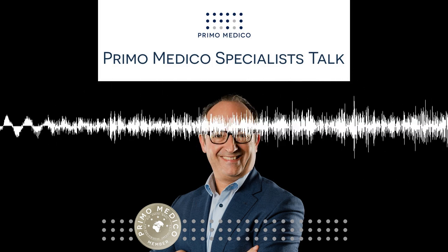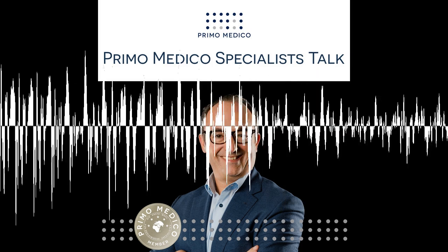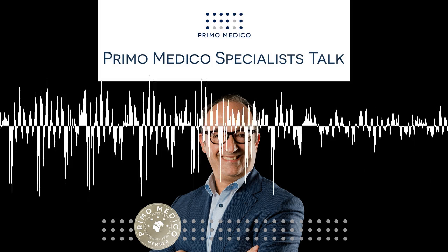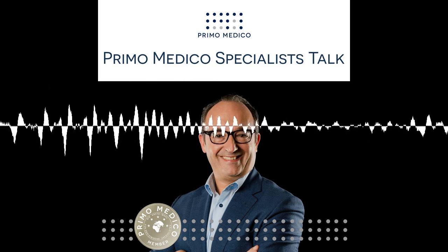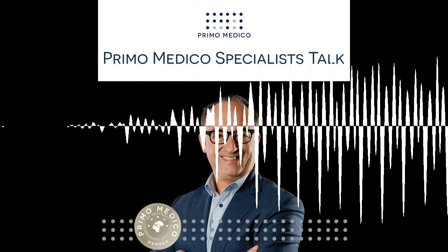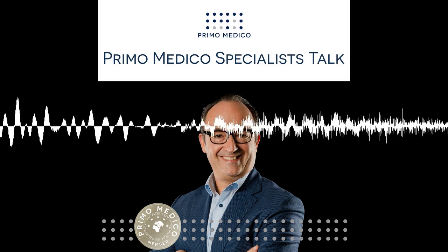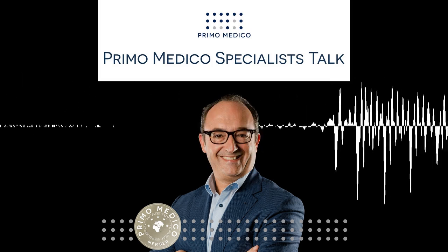From your point of view as a surgeon, is the implantation of a total ankle arthroplasty complicated? Well, the implantation of a total ankle arthroplasty indeed needs an experienced surgeon because the learning curve is quite steep and substantial. Why is that? Because the joint itself is small and very complex in its mechanics. Sometimes you have to manage at the same time, as I said, a malalignment or a ligament reconstruction or tendon transfer. So you need a lot of additional surgeries, in up to 40% of the cases. That's why total ankle arthroplasty is a complex surgery and needs quite some experience.